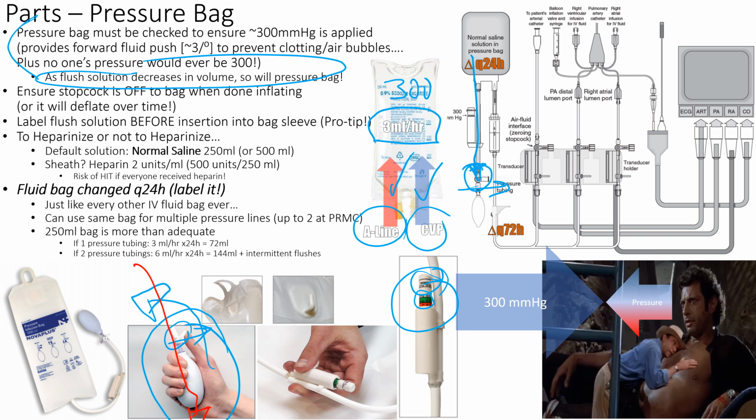You may have seen on TikTok or other little tips and tricks, you can use the air meter and inflate this rapidly. That's perfectly fine. It's going to shh, and you're done, right? You look like you can do balloon animals next, okay? All right, so then what else? So make sure your stopcock is appropriate.